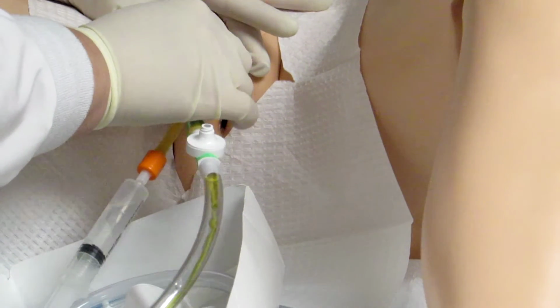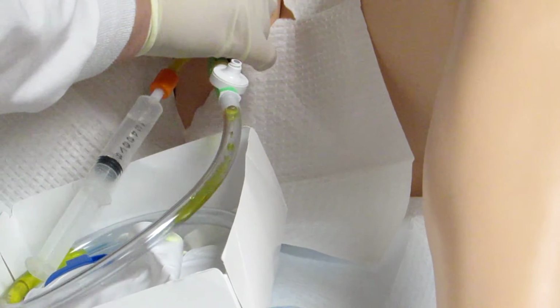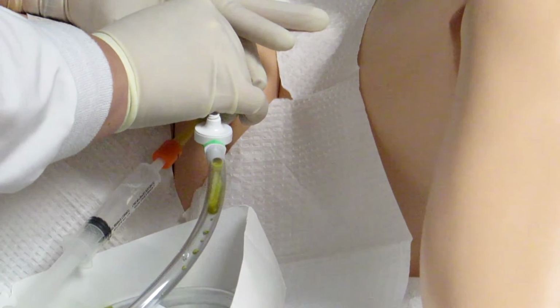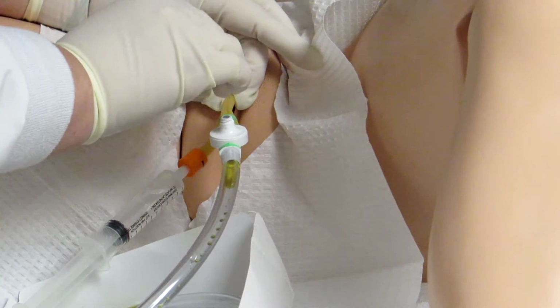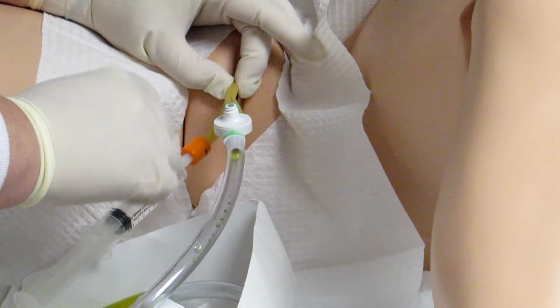Now I'm going to make sure I insert 1 inch to 2 inches farther so that when I inflate my balloon, it's not in the urethra. Now before I let go of this area right here, I'm going to grab a hold of it with my dirty hand and stabilize that catheter. If I didn't grab a hold of it right there, the catheter is going to start trying to come back out because it doesn't want to be in there.